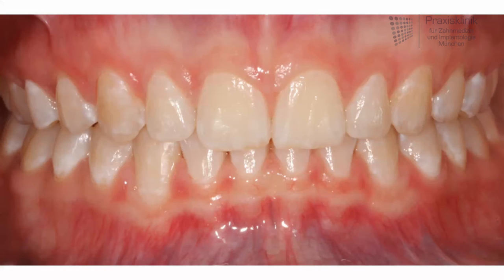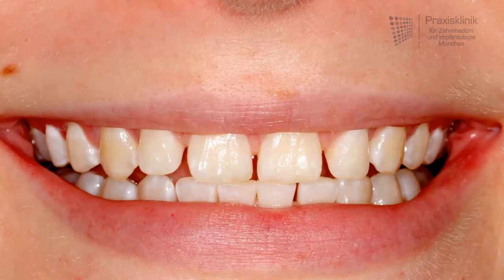And you can see here only three months later the teeth are all in position using small splints. Situation before, situation afterwards.